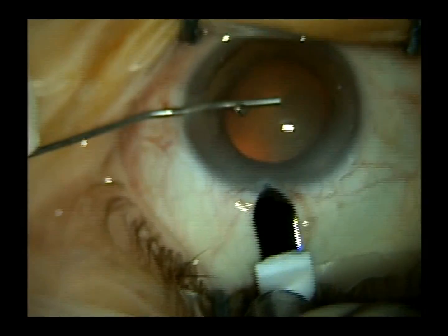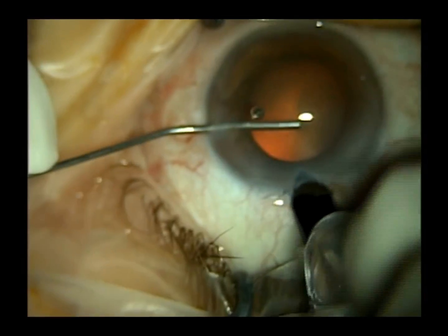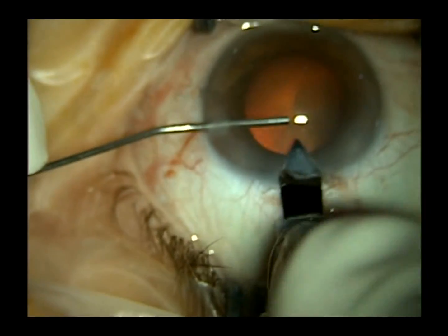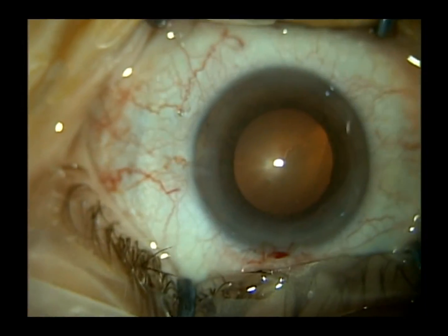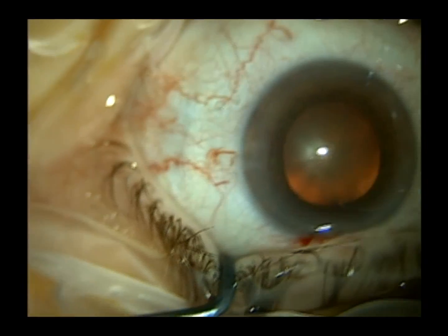And at this point, I can tell that the pupil is not maximally dilated, but it looks sufficiently dilated. So I go ahead and proceed, always hoping for the best, but planning for the worst. That pupil looks to be about 6 millimeters in diameter right now.